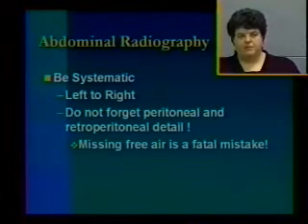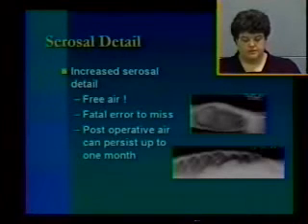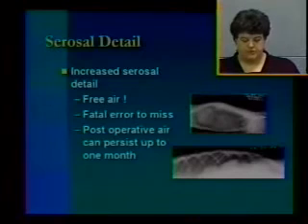I'm going to harp on this a little bit, but missing free air is a fatal mistake. That dog is going to die. That cat will die if he hasn't had surgery recently. So, serosal detail: there's both peritoneal and retroperitoneal. We're going to talk about them differently.